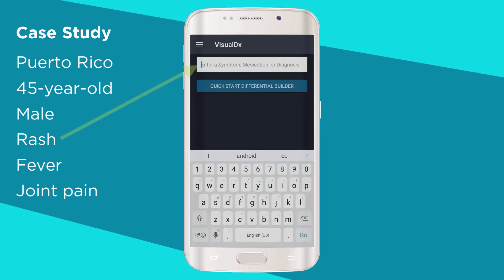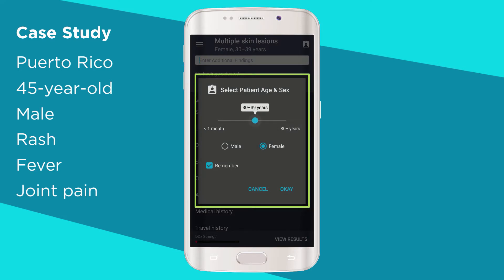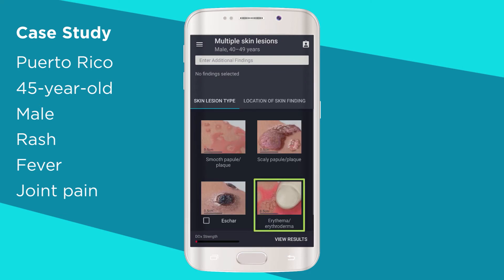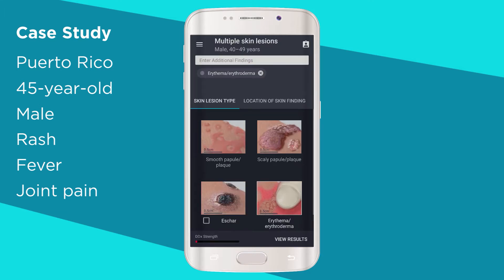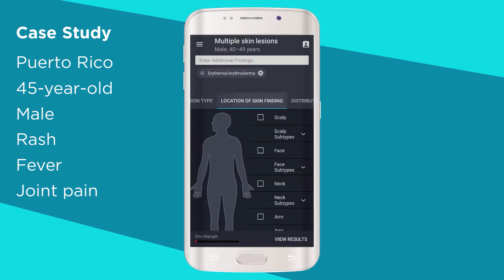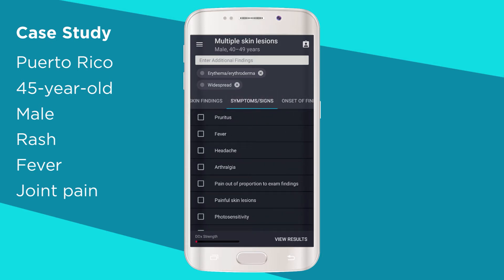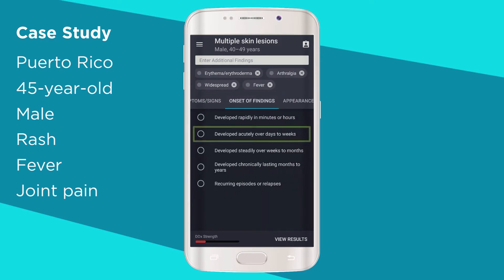Start building a differential by typing in 'rash.' Now change the age and sex of the patient to a 45-year-old male. Under skin lesion type, select erythema. You can refine your lesion type or select erythema to continue. Scroll through the guided workup and enter more findings. Under distribution of skin findings, choose widespread. Under symptoms and signs, mark fever and arthralgia. Then enter the onset of findings as developed acutely over days to weeks.